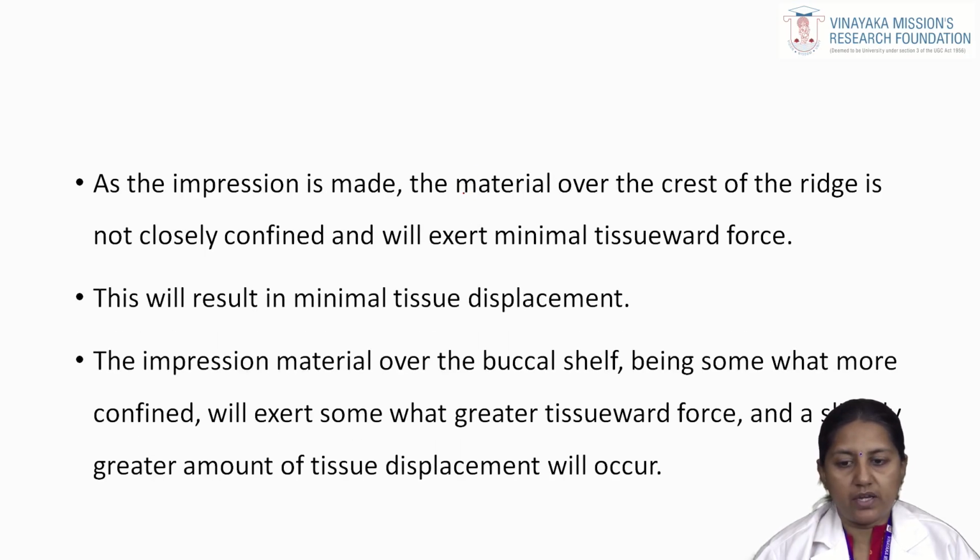As the impression is made, the material over the crest of the ridge is not closely confined and will exert only minimal tissue-ward force because we have already relieved the crest of the ridge. This will result in minimal tissue displacement, whereas the impression material over the buccal shelf area, which is very much confined, will exert a greater tissue-ward force, and a slightly greater amount of tissue displacement will occur.